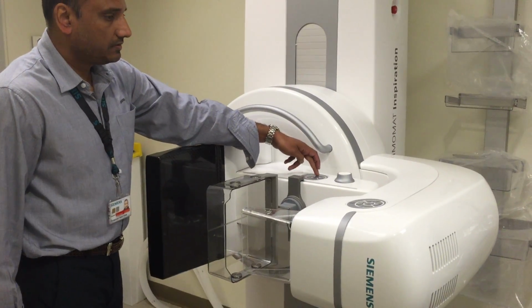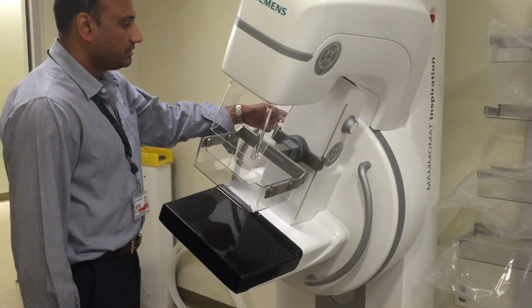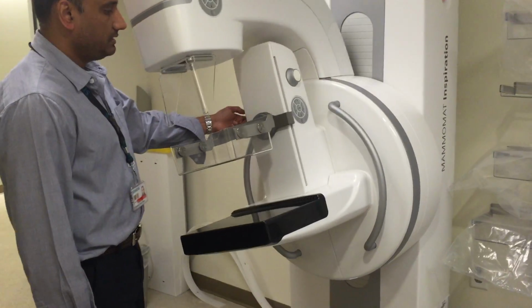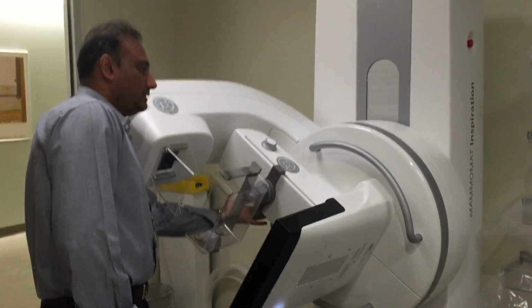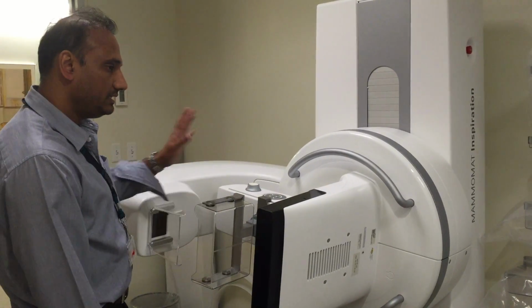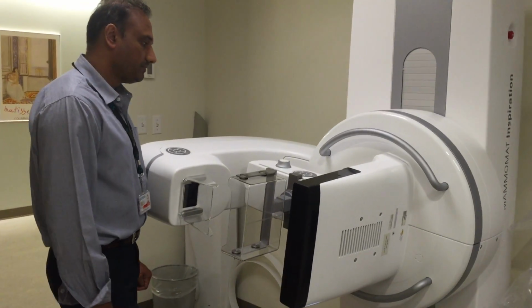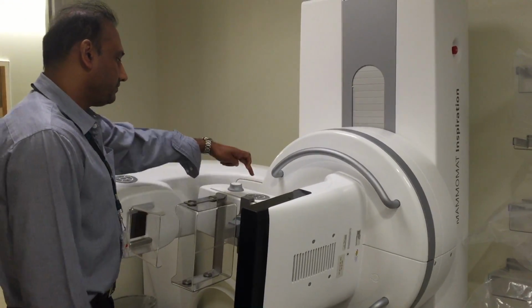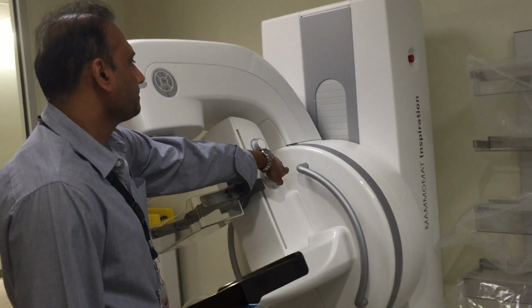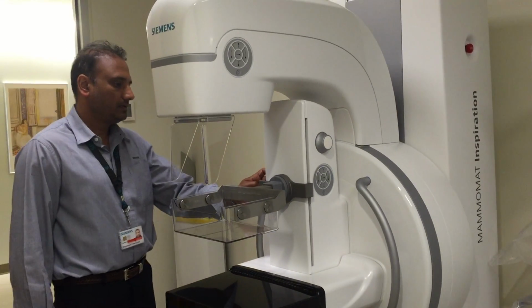Do you have a remote control, like a TV remote control you usually have? Maybe on the console, right? It's not on the console. That's right. So it goes to negative 180 and then positive 180. So 180 on the left side and 180 on the right side. Okay. So in total, you're talking about 360-degree movement. Right. What is the button in the center there? Okay. It's going backwards.